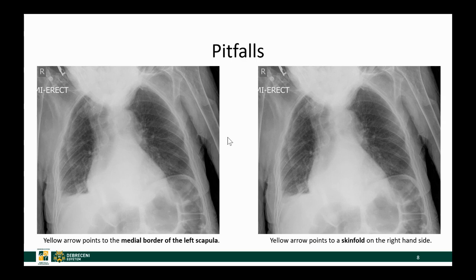Sometimes we will see white lines on chest x-rays which are not due to a pneumothorax. Here is a line projecting over the left lung — this is also a white line, however it doesn't mimic the normal contour of the lung and beyond this line we see normal lung markings. So this cannot be the white line of a pneumothorax; as you might have guessed, this is the medial border of the scapula.